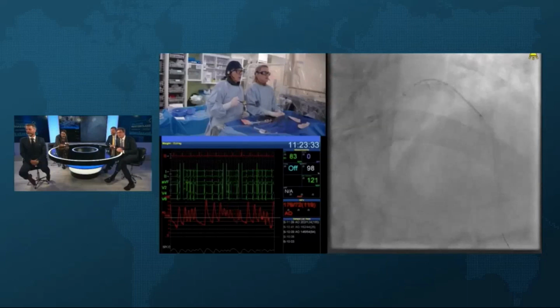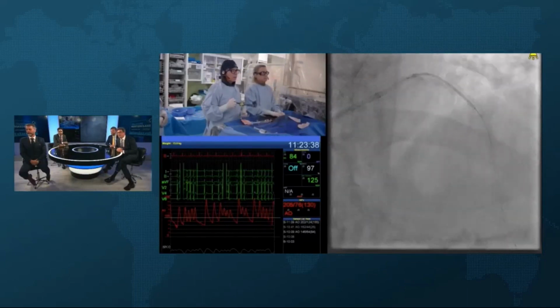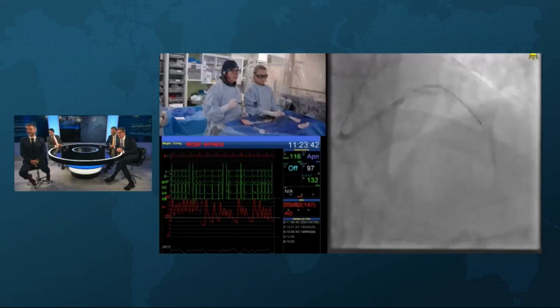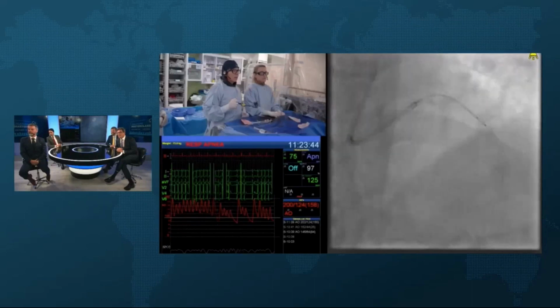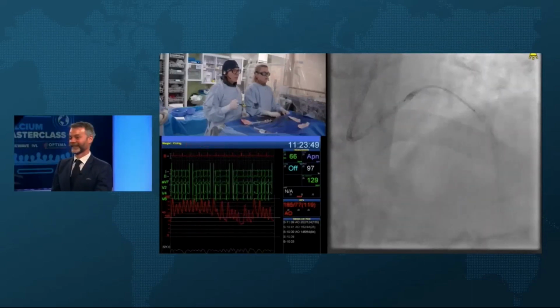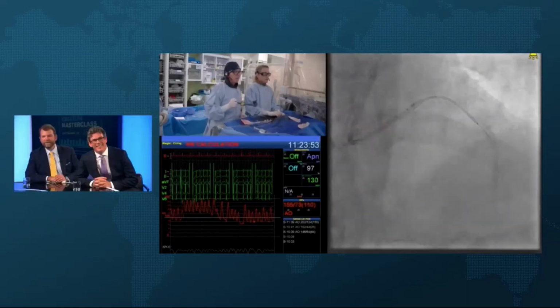It's probably because of that. Honestly, good move on that, guide extension back, guide in. This is 38 as well, just for Jonathan's sake. Okay. So he's missing 10 millimeters of stent here. So we're going to back up till we minimize our overlap and then just check where we land. It's the subplot of the calcium masterclass. That's most interesting. That's good.